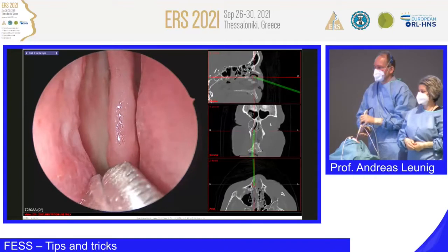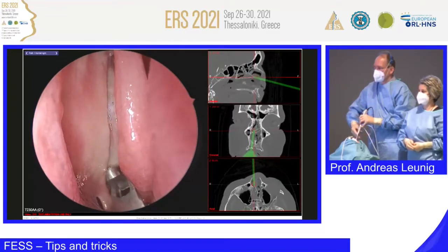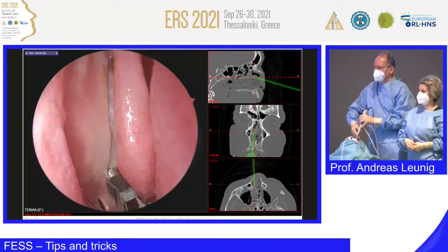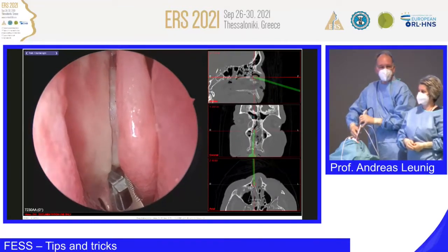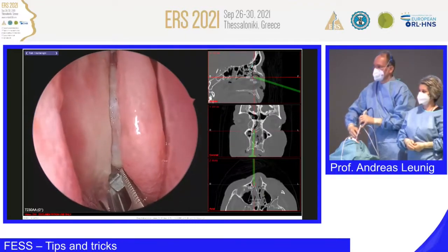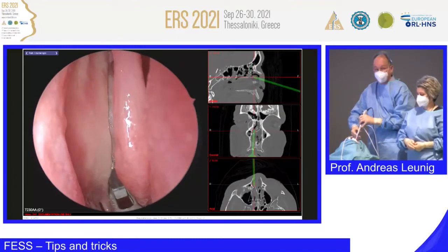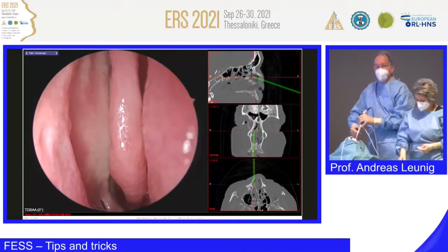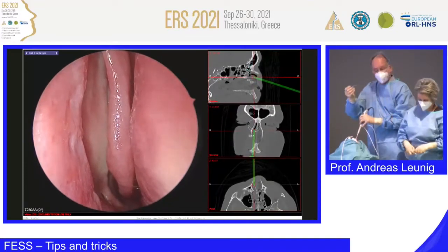oops, I'm now out, I come in again, I go in, and you try to slip, hopefully it's working, behind the uncinate process, behind the free margin of the uncinate process. And you can see now I could cut. But I want to show you two techniques. This technique, but let me make the first cut, the anterior technique, and then you have seen already two techniques.